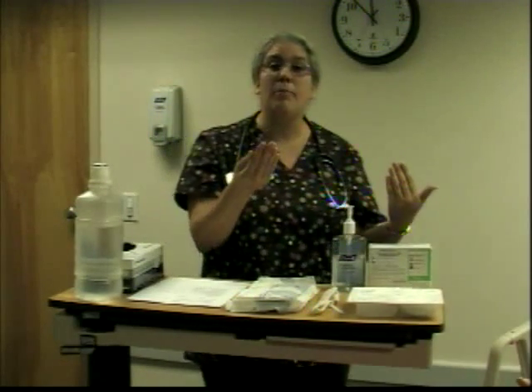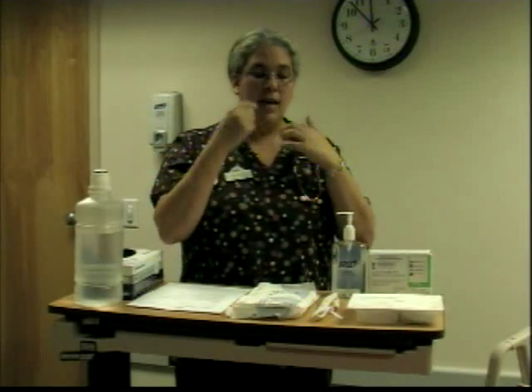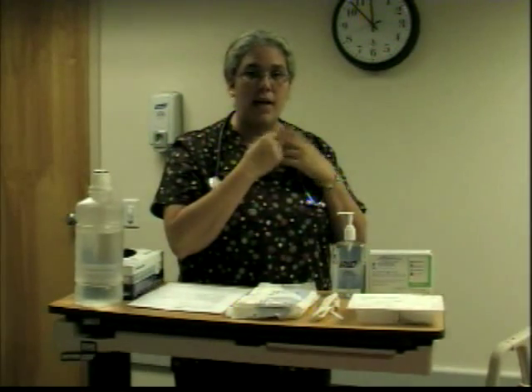Also, if the patient is confused, make sure you have somebody to help you, because this is going to be uncomfortable. Remember, you're right here on the trachea, and this is a very sensitive area, and the patients are not going to be very happy about you putting a catheter down in there and suctioning. So you want to make sure that you have somebody to help. Now we're just going to pause for a second. I'm going to get everything together, and I'm going to give you a demonstration on how to do this.